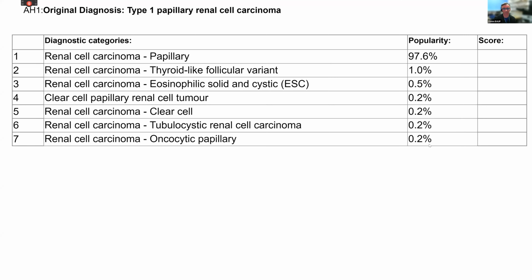There is an entity with that reverse polarity, but it's not typically called oncocytic papillary, but it's in the papillary category, and it might be worth being generous in marking that one, but probably 1 scores 1 and then the rest, 2 to 6, score 0, and I would say to be generous with question number 7.